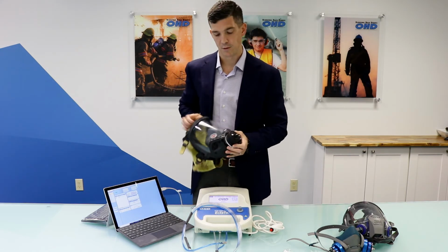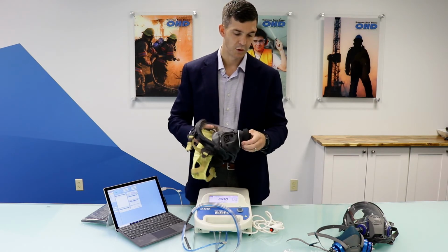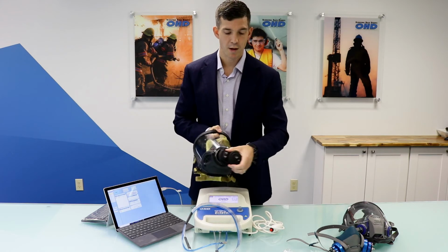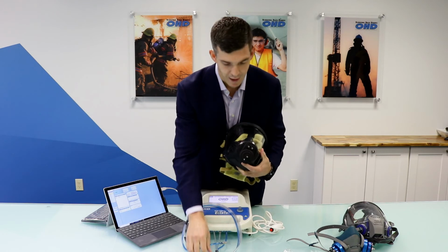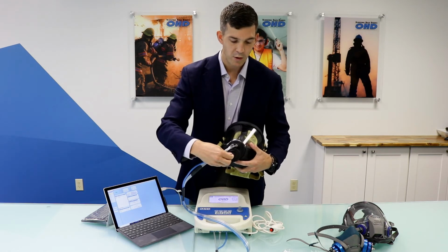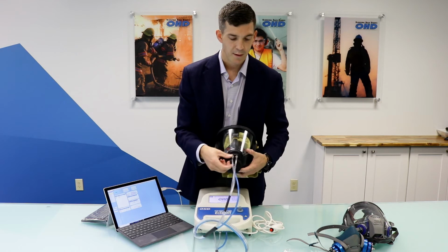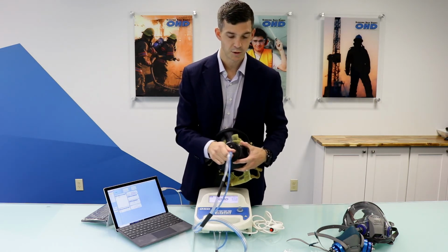And let me turn it around. So you'll connect this up to the front of the mask and we'll twist lock it on like this. So this one connector will twist lock on. So there is no converter. So now our two clear tubes would come to the front and our one blue tube would go to the bottom. But either way, as you can see, it should be a nice clean look and everything there. So no crossover on the adapter ports.